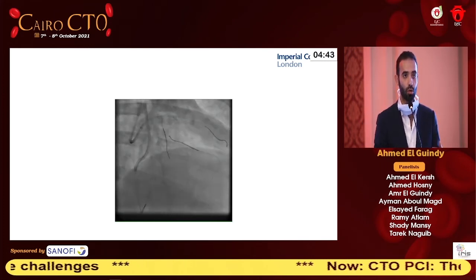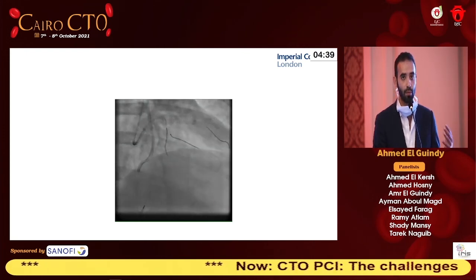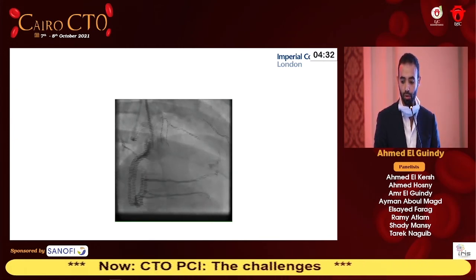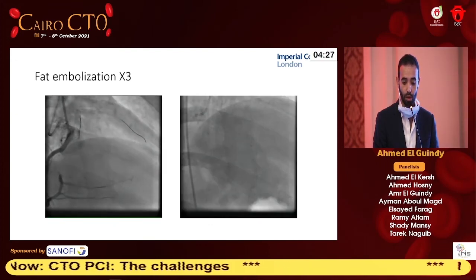You want to go out when the bleeding has stopped, because they can continue. This is a very mobile part of the heart. These are very fragile vessels. They can continue to leak overnight, and they call you at 2 a.m. in the morning with a tamponade. So you want to leave the lab with those controlled.